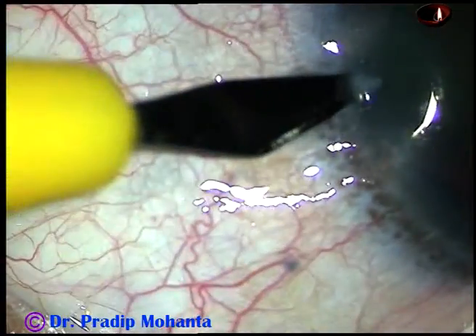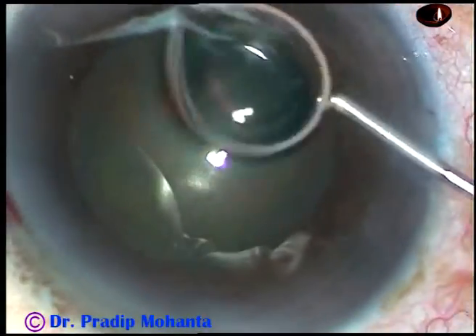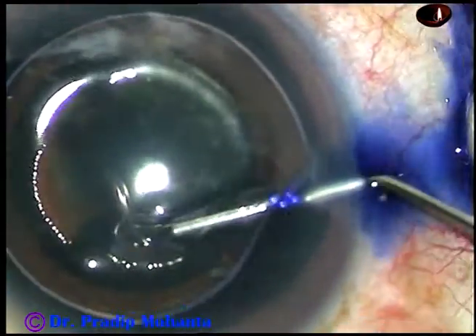By this time the main incision and two side ports have been made, and now there is an air bubble. I want to stain the anterior capsule of this cataract with trypan blue dye underneath this air bubble.